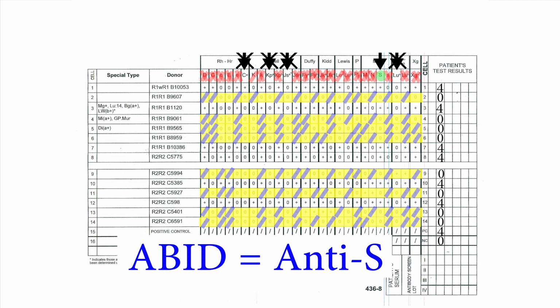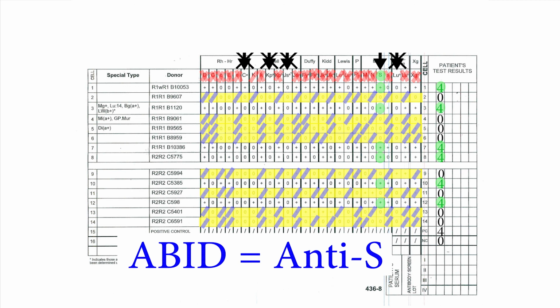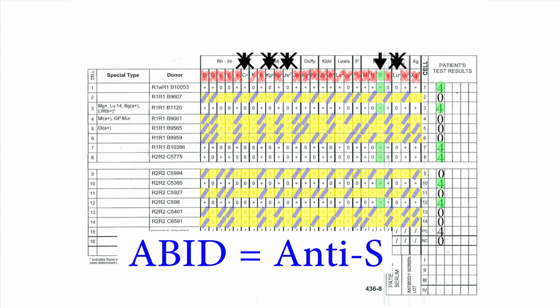If you take a look at the big S pattern, you will see that it matched the reaction perfectly. Wherever there is S antigen present, there are positive reactions. Be very cautious and keep in mind that it is not always this way. When there are multiple antibodies and/or antibodies that show dosage, the patterns may not match exactly.